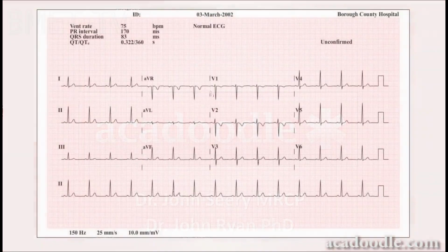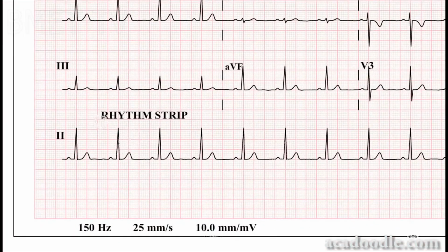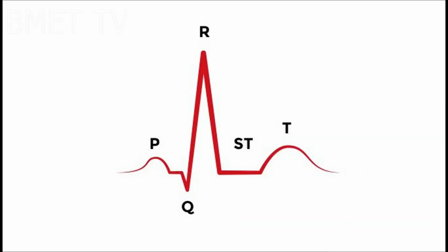When you are looking at an ECG paper or EKG, you are seeing electrical impulses generated by your heart that are being transferred to clamp and bulb electrodes, which in turn display those impulses on a screen for you to analyze. Before you can start analyzing heart rhythms, atrial fibrillation, atrial flutter, ventricular tachycardia, etc., you must know the basics about the PQRST wave. Now, let's break each part of this strip down and talk about what each area represents. You always read the PQRST wave starting from left to right.